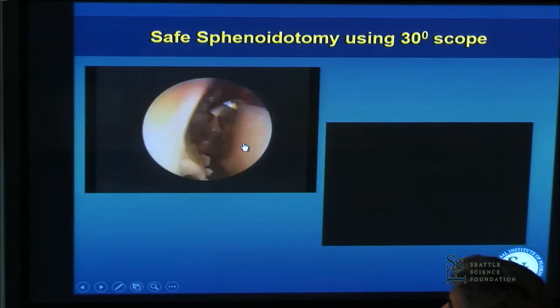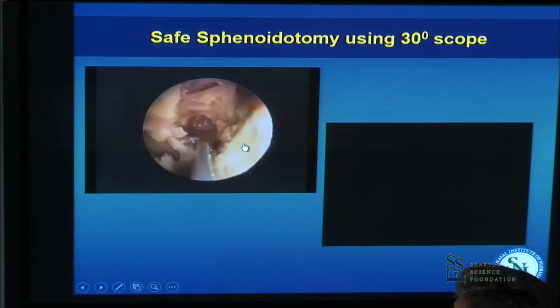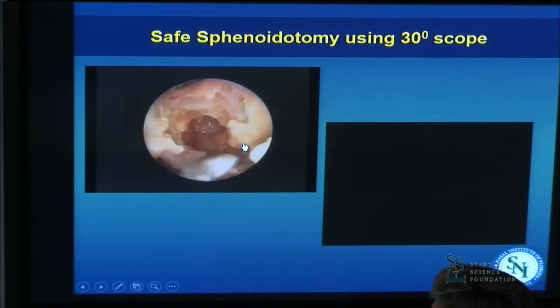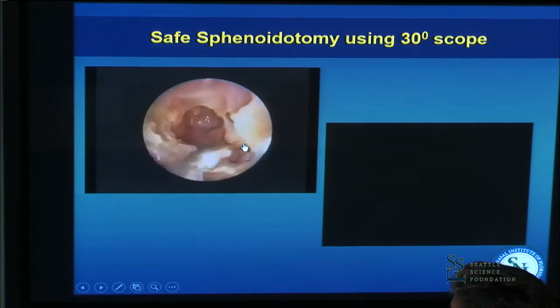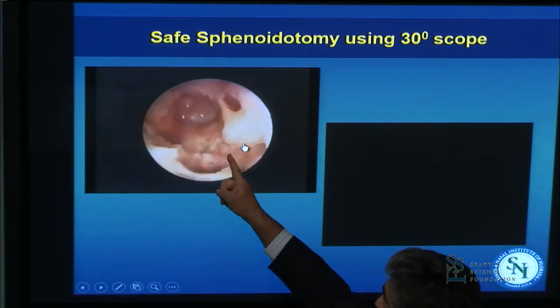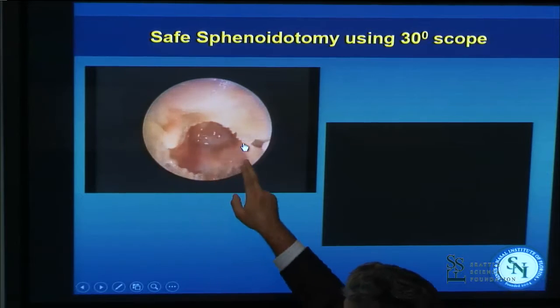Regarding the superior turbinate: be careful about how you trim it because it does have olfactory fibers on it. Using a J-Curette to point in and around the superior turbinate here, the natural ostium of the sphenoid is right there, and then this gets enlarged around into here.